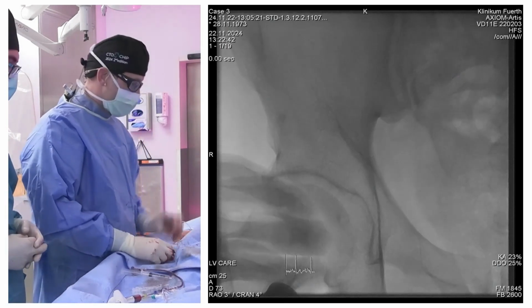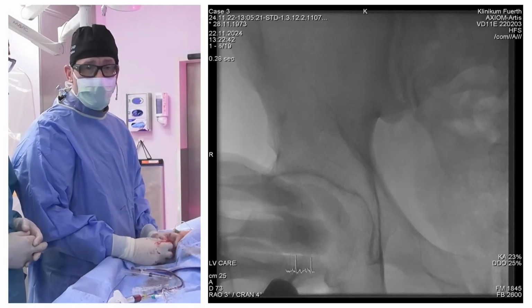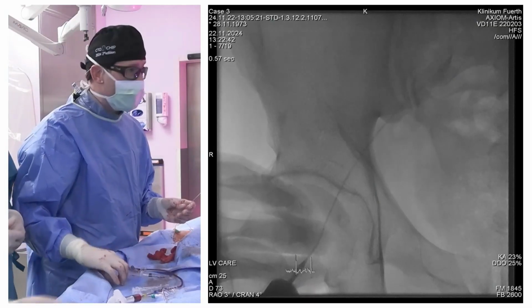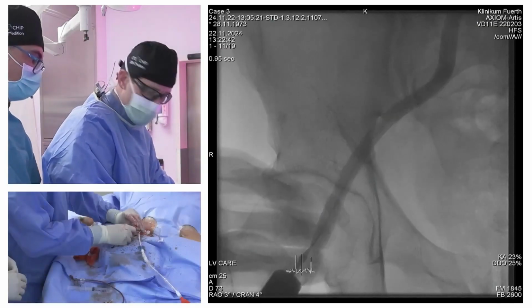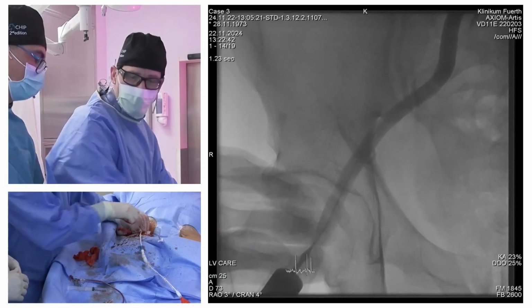Yeah, it's running. We have a running support already, of 3.5 liters right now. I don't know if somebody stopped the time, but it was probably not a long thing. You appear really relaxed and talk to us, and meanwhile it's inside.